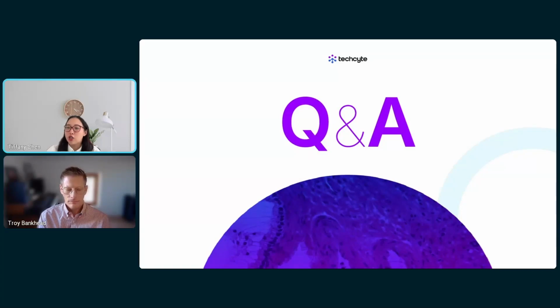Yeah, no, that's a good question. I feel like it's always very relevant in our modern era of technology. But I think for frozen section, because what we're doing here is specialized reporting and we're giving another way of communication, that doesn't take away from the original means of communication. So you can still call back to the OR, how you've been calling back, and then log it retrospectively. So it doesn't take away from existing practices. But yeah, I think that just comes with the nature of technology. If there are some network issues, thankfully there's the fallback of doing it manually.